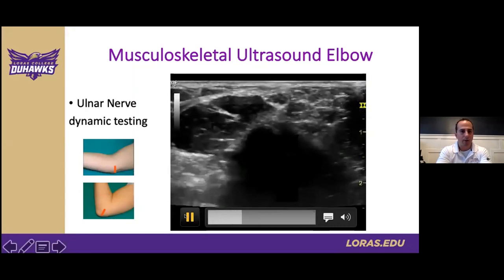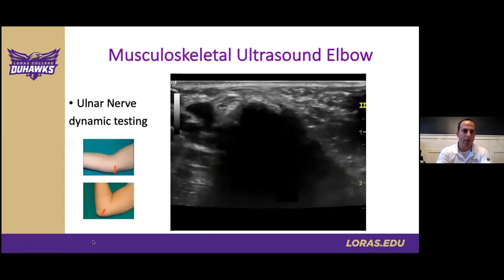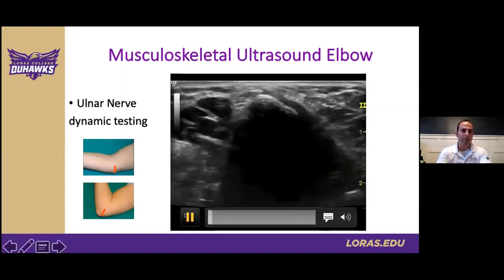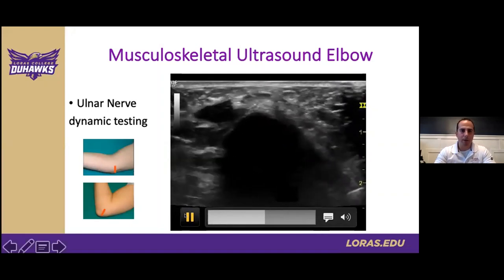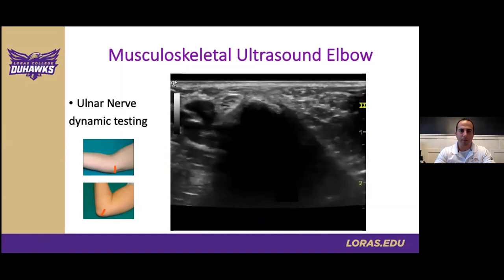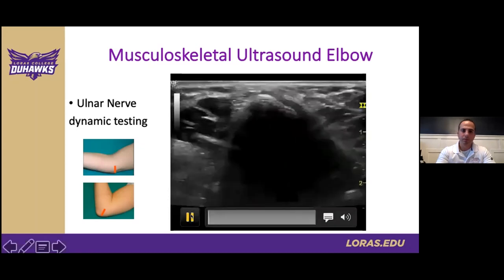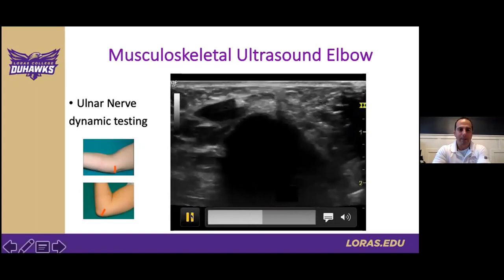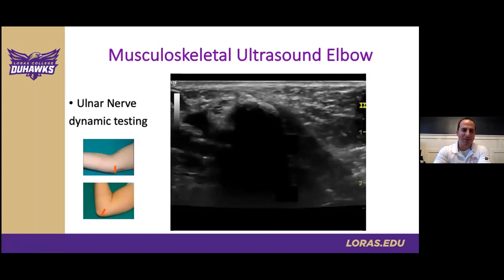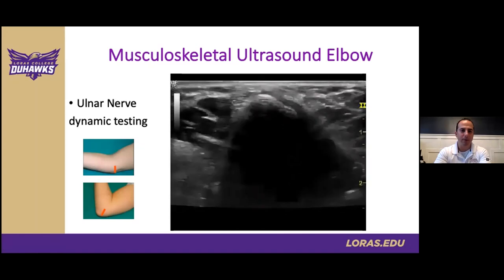Here's the video as we dynamically test the ulnar nerve and watch it slide over the medial epicondyle. You're trying to put enough pressure on the elbow to find this happening while being careful not to apply excessive pressure — and you'll slide a little as this occurs while maintaining probe contact on the elbow.